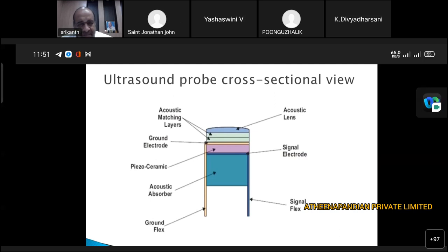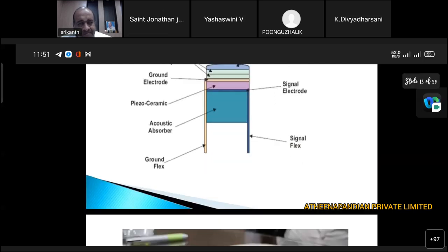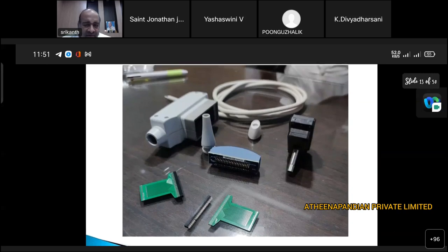The next slide, madam. This is the exact parts of an ultrasound probe. You can see there are two PCBs, there is a connector here, and there is a crystal. So you can see the crystal. There are a lot of pins there, no? That's the crystal. And these are all different parts; we actually buy these and we assemble. It's not easy to assemble. We have to solder either 80 cables, 80 elements, or 120 elements, or 196 elements, or even 64 elements sometimes. So this work we do in our factory. Next one.